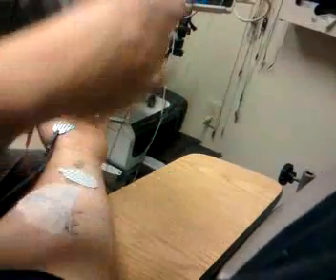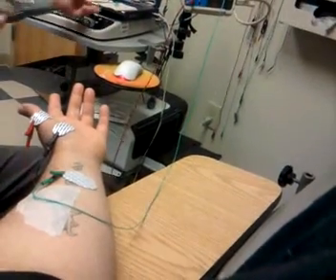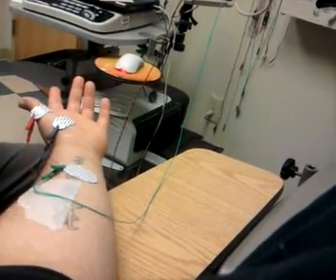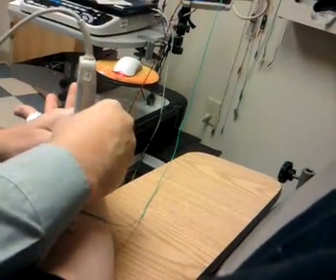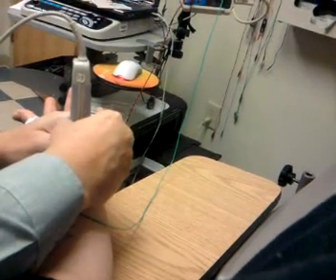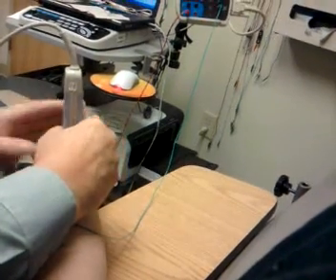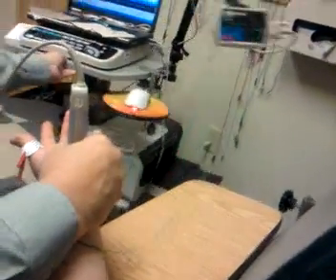And then the clock. Now let's turn on the machine. I've got a signal coming in — see that? All right.